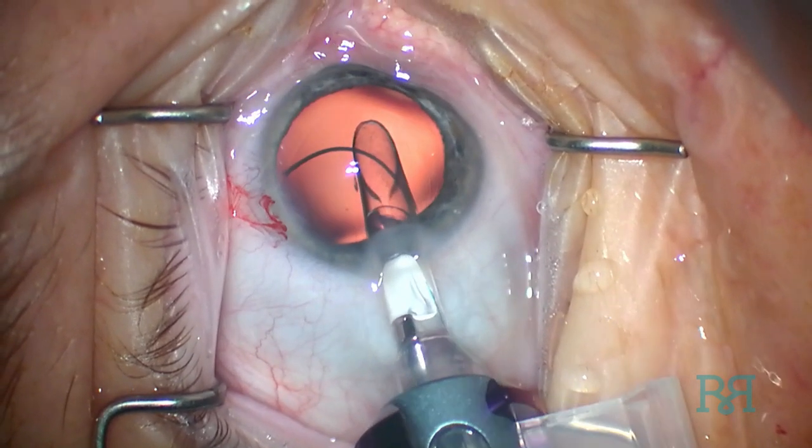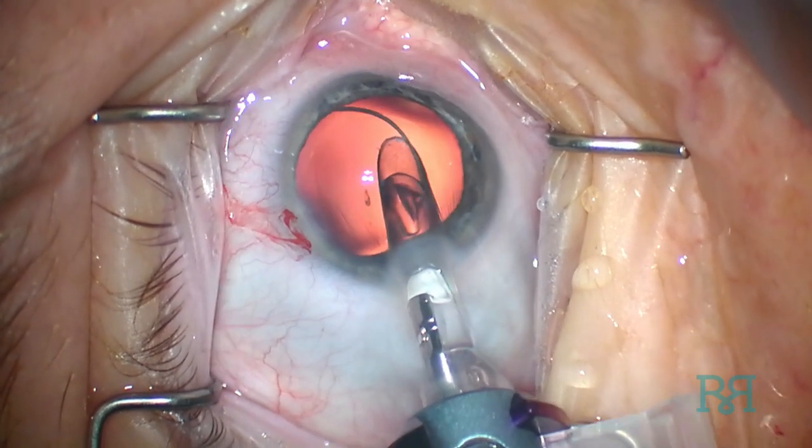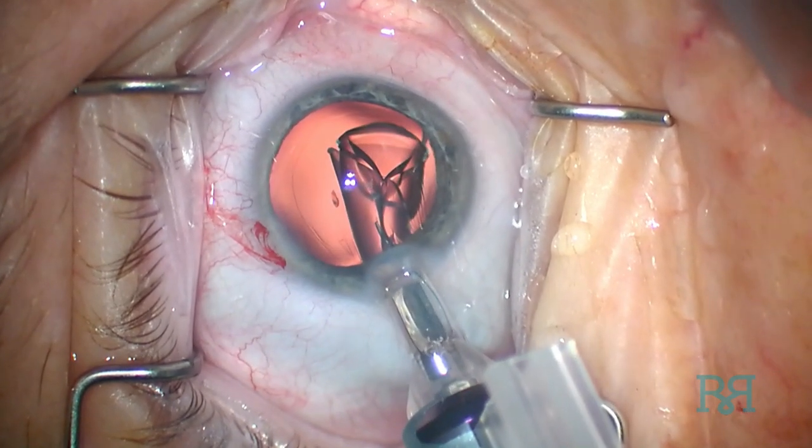As the optic begins to come into view, the entire handpiece is rotated counterclockwise to facilitate opening up of the optic in the correct orientation.